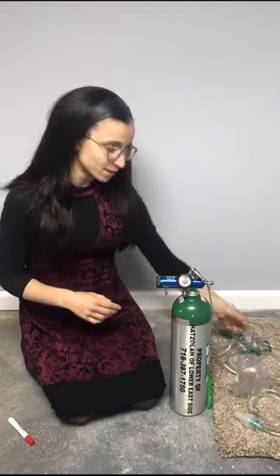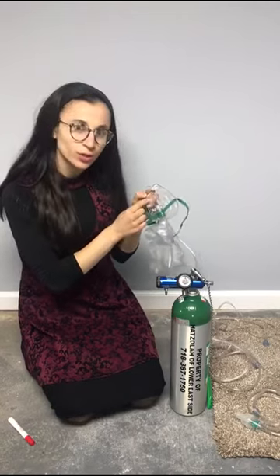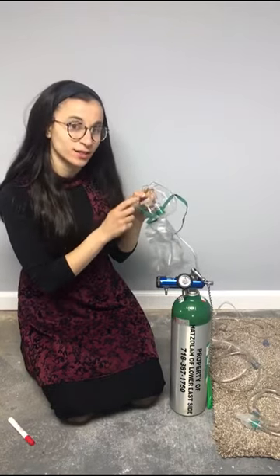The Venturi mask is the same thing. It just comes with, instead of this, little color ports. And you put in the colors based on the numbers.